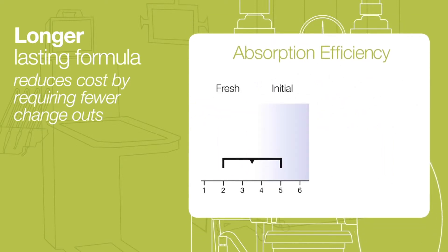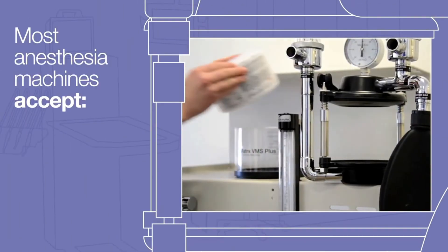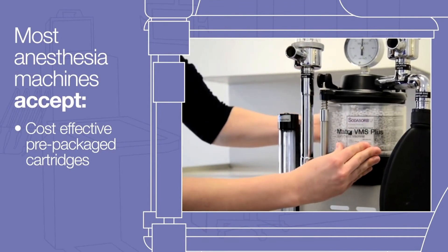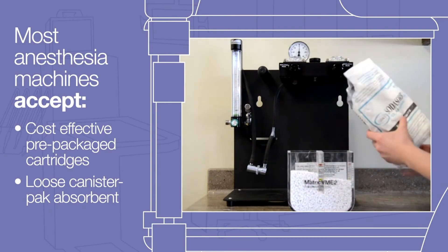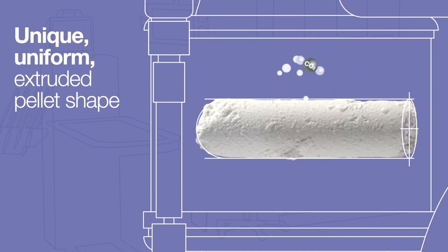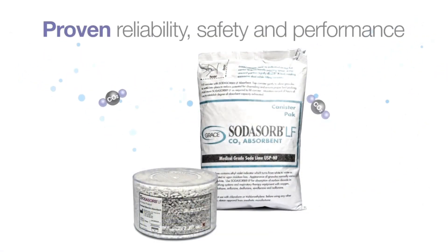Instant color change is normal as the product works. Absorbent change out is only required when the product coloration matches that of the exhausted or desiccated boxes on the Midmark color chart. Most anesthesia machines are designed to accept both the cost-effective pre-packed Sotasorb LF cartridges as well as canister pack bags of loose absorbent. Featuring a unique, uniform pellet shape, Sotasorb LF reduces caustic dust content, making machine cleaning easier and reducing resistance to the anesthesia gas flow. Sotasorb LF provides the proven reliability, safety, and performance to ensure the comfort and well-being of both patients and staff in your clinic.